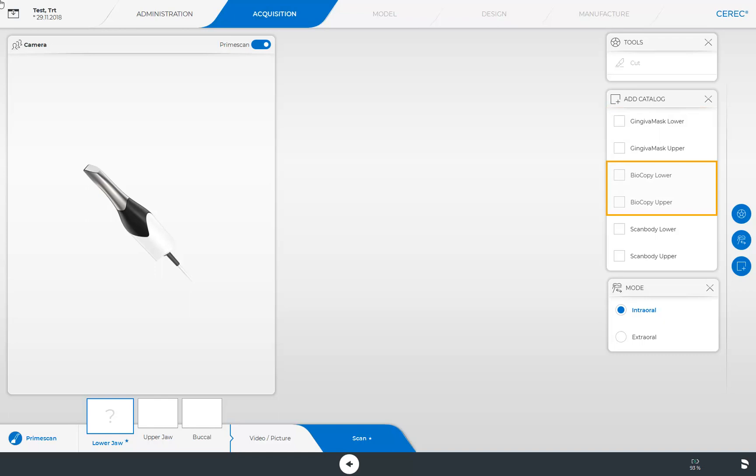The biocopy lower and upper jaw image catalogs will be added automatically as soon as the design mode has been selected in the administration phase. These image catalogs are used for scanning the morphology of the tooth to be replaced before the preparation or extraction. The CEREC software has the capability of transferring the design to the new restoration.